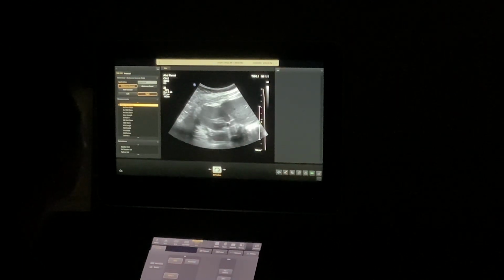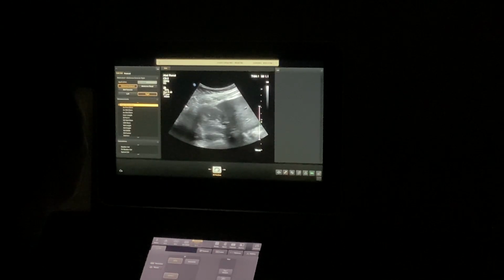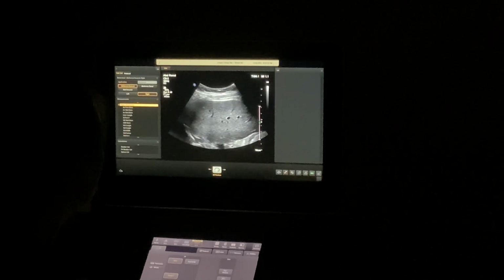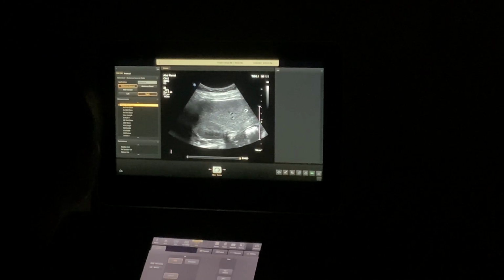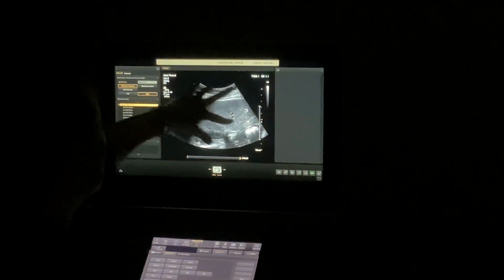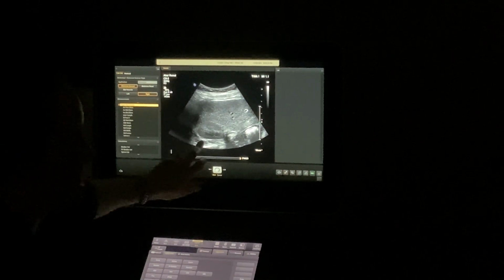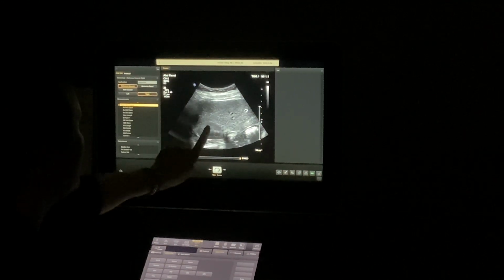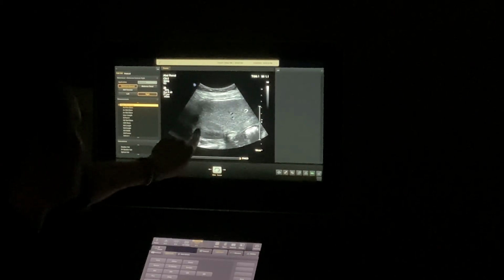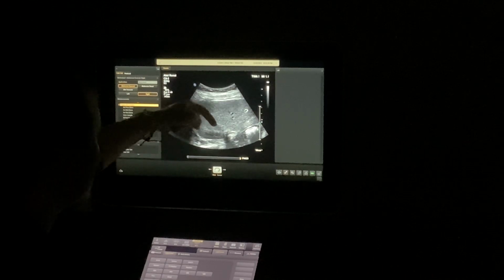Okay. So superior kidney, losing contact again. There we go. Breathe. Okay. Make sure I had contact. So we're getting a lot of liver in your superior kidney picture for trans, okay? No hilum, no sinus, no blood vessels, just representing this very upper part of the cortex of the kidney and making sure I can see these margins.